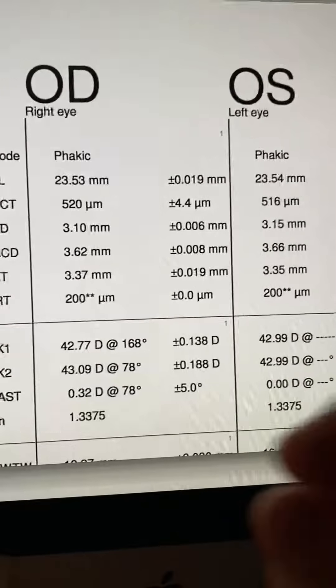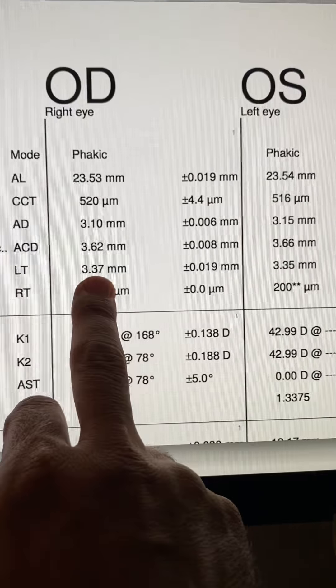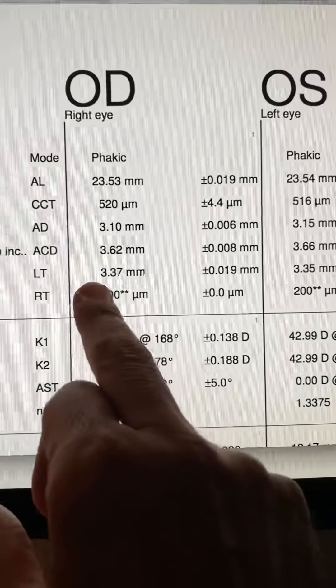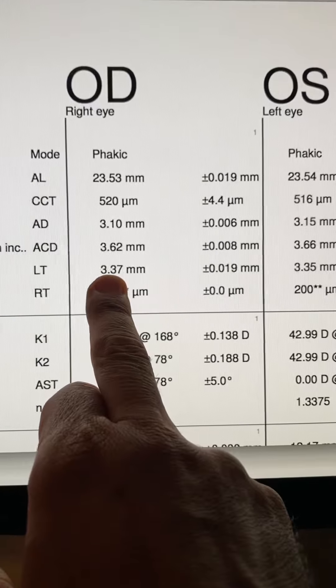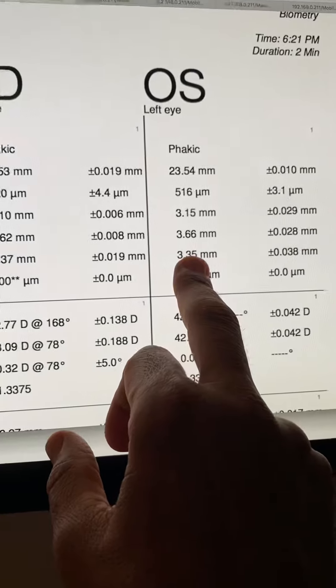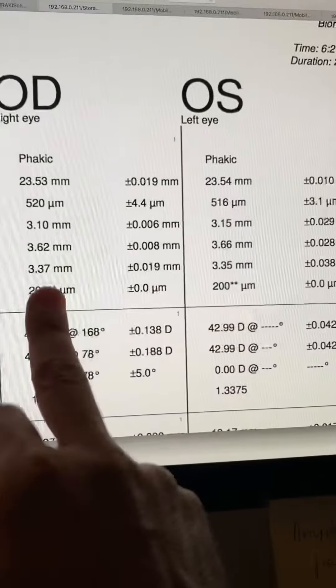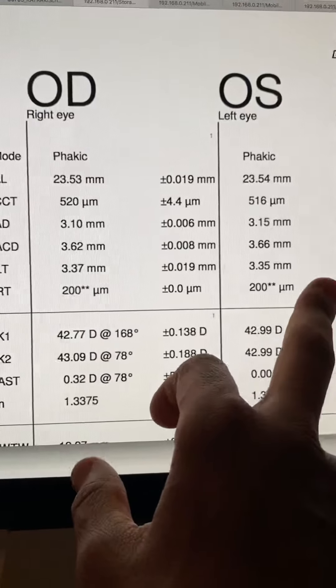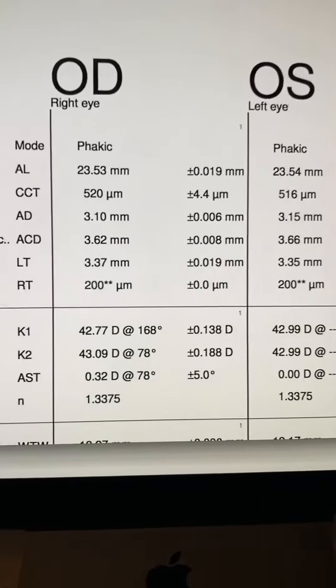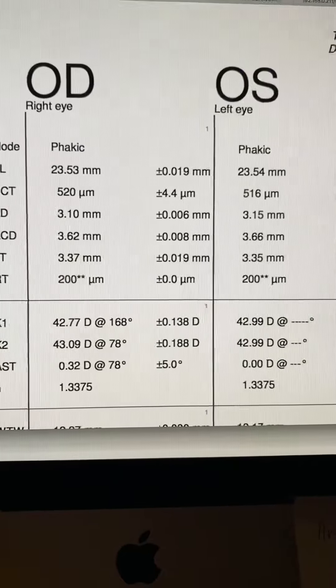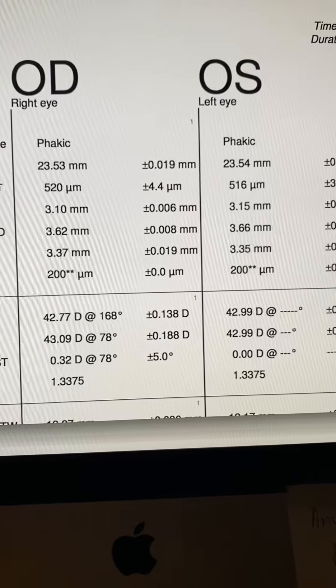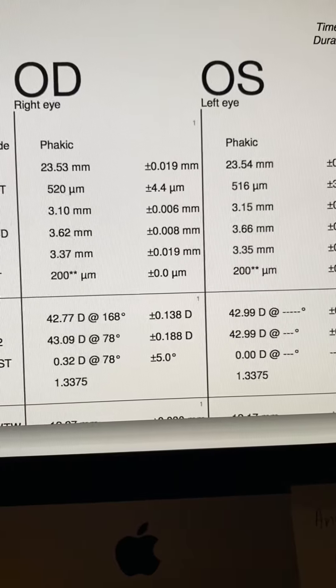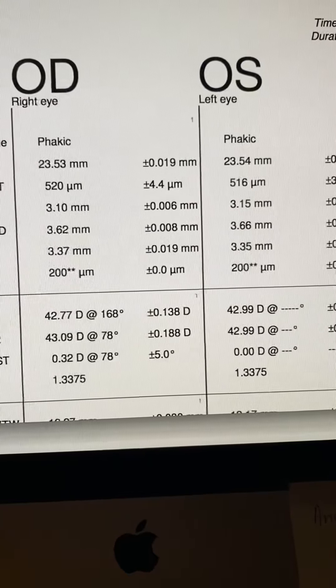Again, another way to evaluate cataracts, especially in a hyperopic young patient: his lens thickness is only 3.37, 3.35. Usually hyperopes are in a constant accommodative state, and their lens thicknesses are thicker than normal. This is absolutely normal thickness for that age. Another factor that also votes towards the direction of no cataract and probably a little bit of malingering from this patient.